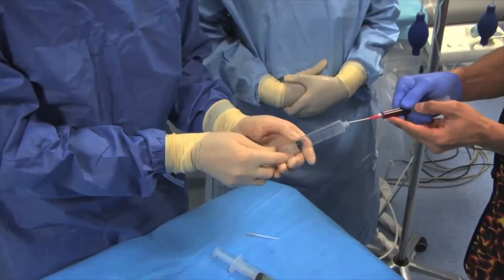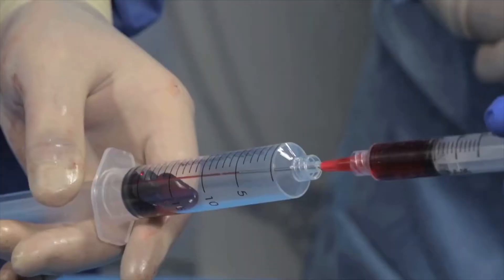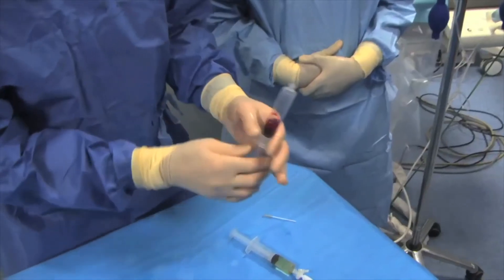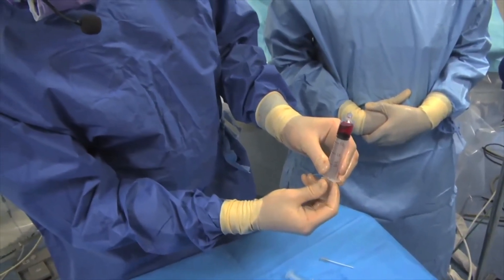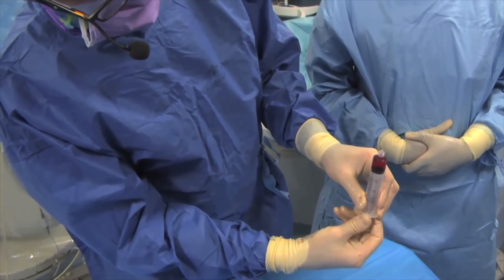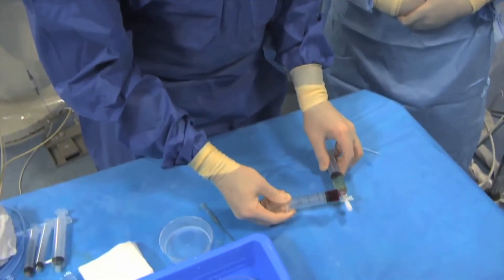It's very important that the doxorubicin is diluted in very small volumes. As you can see, all 50 mg of doxorubicin are within 5 mL of saline. That will favor water-in-oil emulsions, which have some benefit versus oil-in-water emulsions.